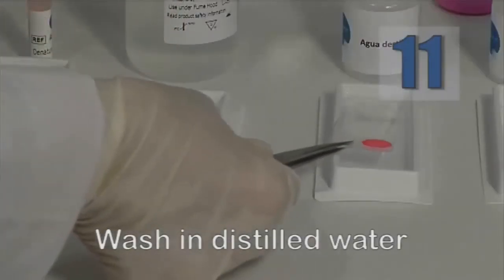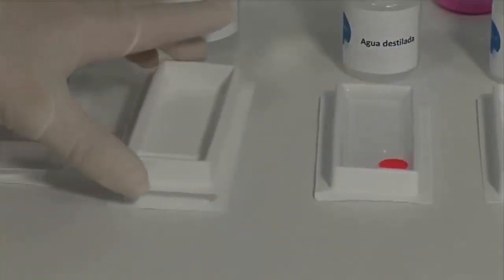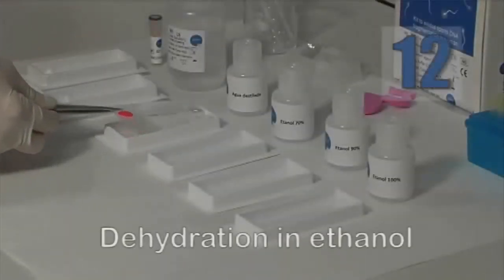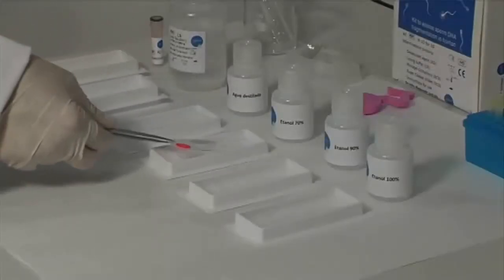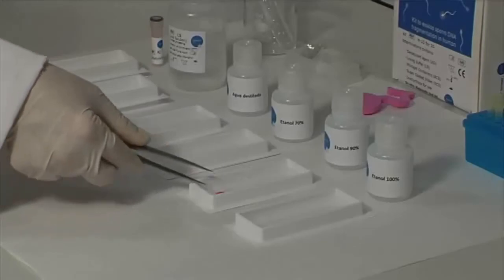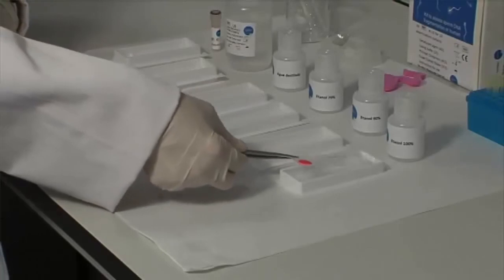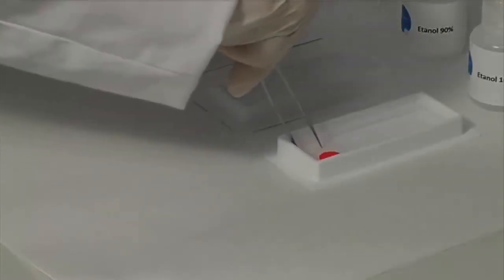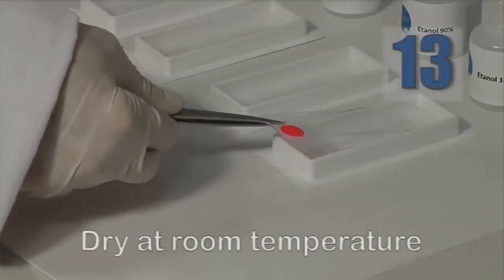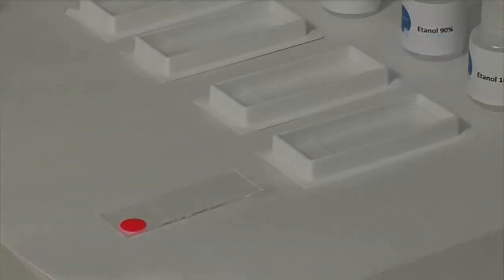Remove the slide from the lysis solution and wash in distilled water during 5 minutes. Incubate sequentially in ethanol at 70, 90 and 100% for 2 minutes each to fix the sample. Leave the slide to dry at room temperature. Once fixed, the slides can be stored indefinitely and stained at a later stage.